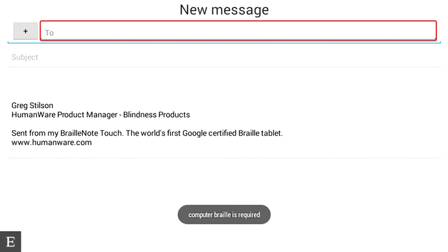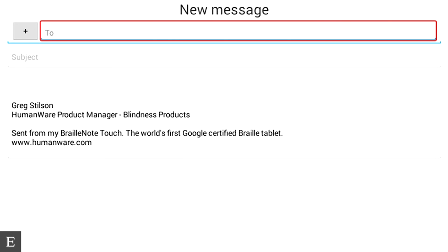You may have heard a little rising tone. On the Braille display, I see a little set of brackets with a cursor in the middle. It says Computer Braille is required. When typing email addresses and passwords, we require the user to use Computer Braille. We're going to type in the email address we're sending to. That rising tone and the cursor on the Braille display means we're in edit mode. Because the BrailleNote Touch has the ability to use first-letter navigation anywhere, we need to tell the device when we want to be in edit mode.